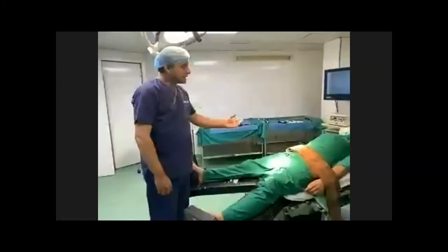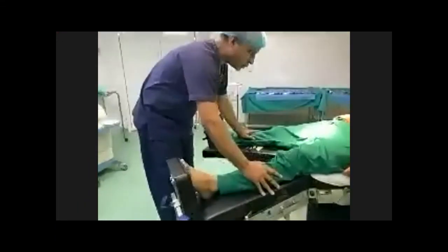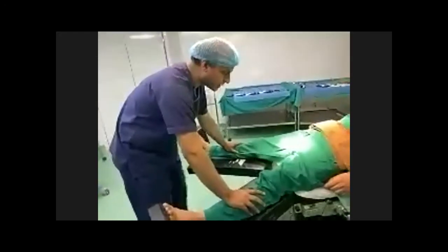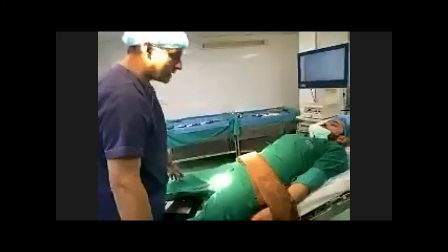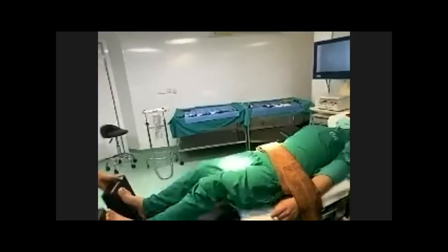So the head end is up. This is the reverse Trendelenburg position. You can see that we can fix these legs and tie these legs over here to give more comfort to the patient. We usually do it in the bariatric procedures, and we perform the surgery standing right here between the legs, especially.